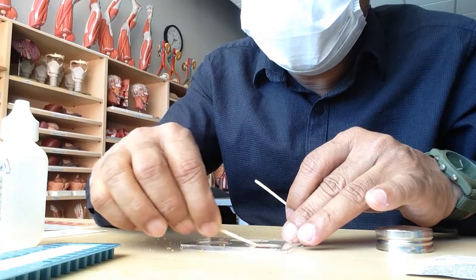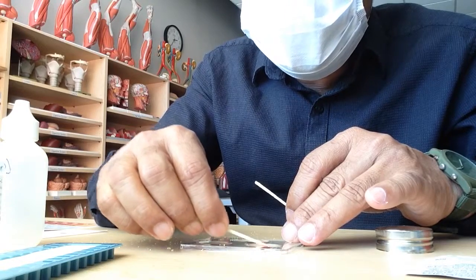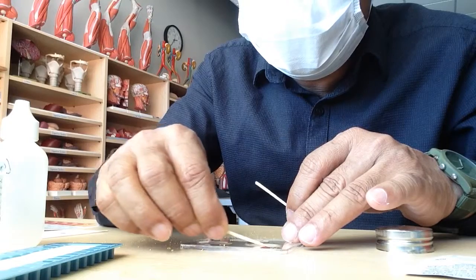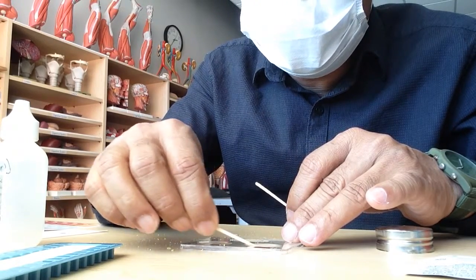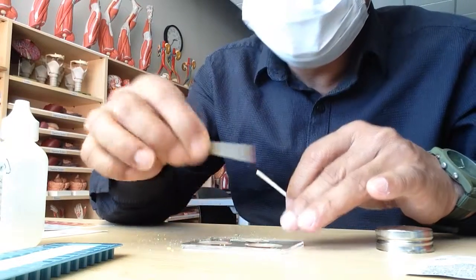Mix gently and spread on the plastic container, spread the blood. So if any agglutination or clot is formed, you can see clearly.